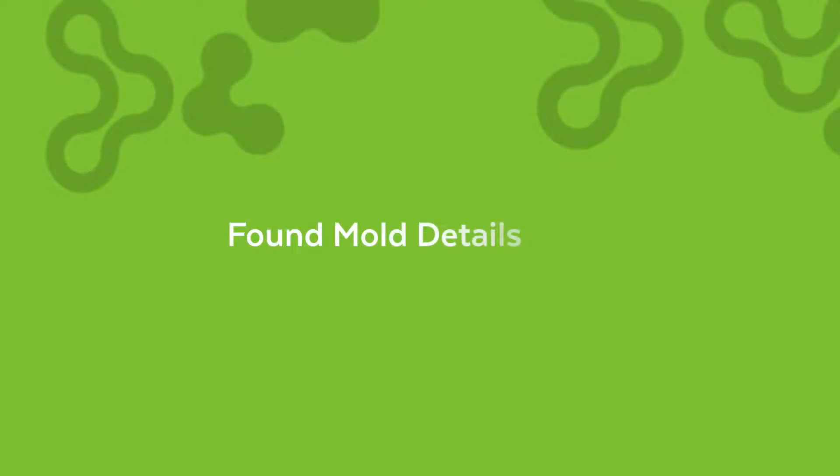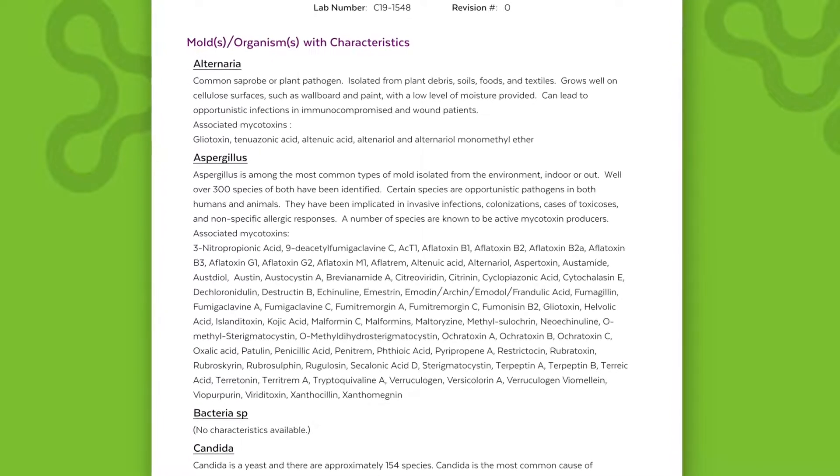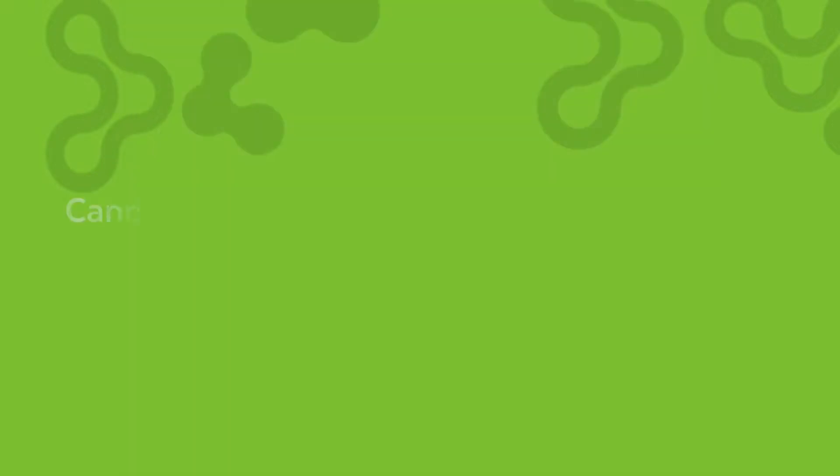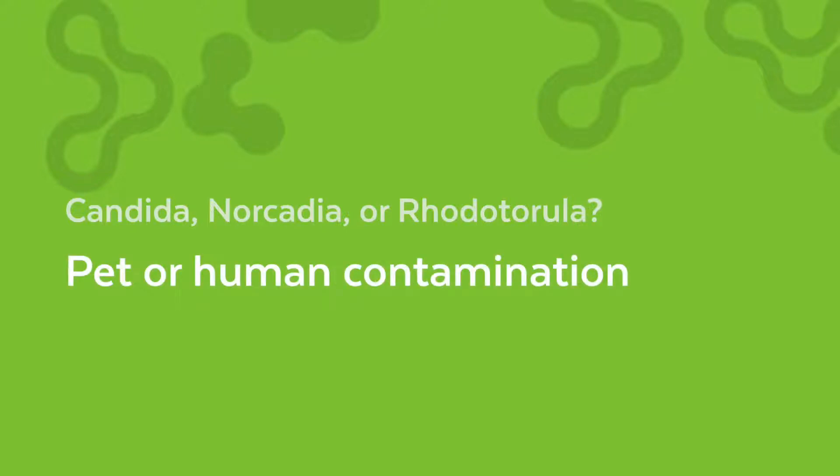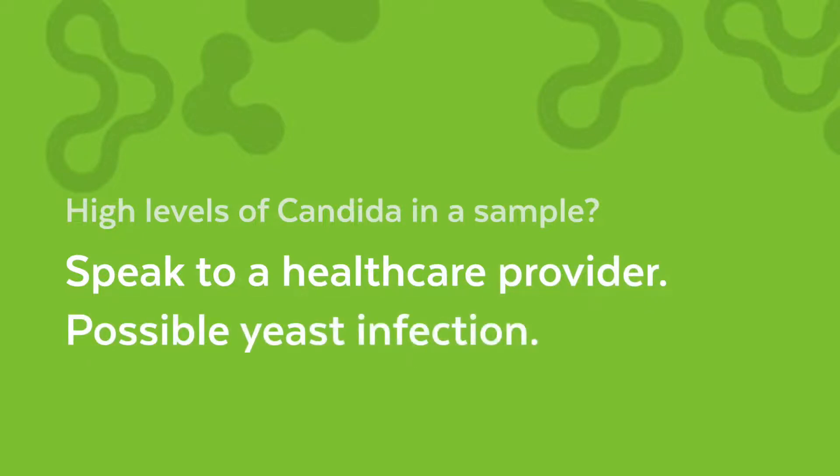The final pages of your report list the mold that was present with a description of that mold and where they're commonly found. For example, if Candida, Nocardia or Rhodotorula is found, those are usually indicative of pet or human contamination. If Candida in high levels are found in any of your samples, you may want to talk to your health care provider as it might be an undiagnosed yeast infection.